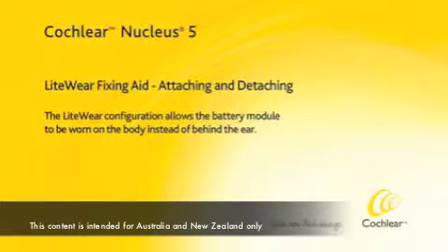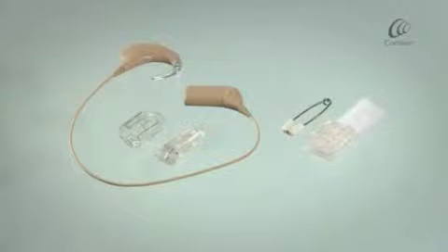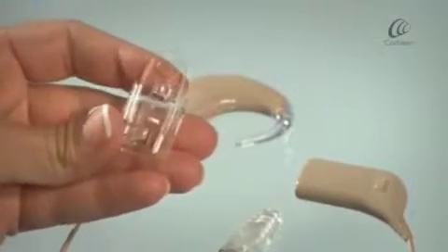The Lightwear configuration allows the battery module to be worn on the body instead of behind the ear. Connect the Lightwear case to the fixing aid by twisting together.